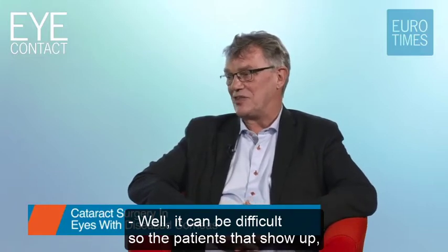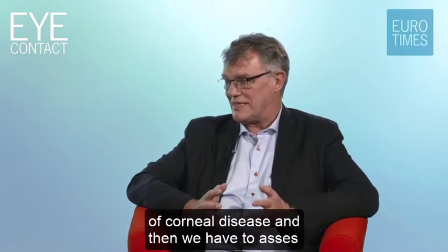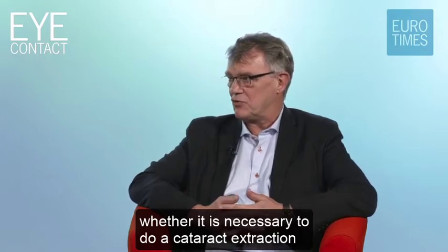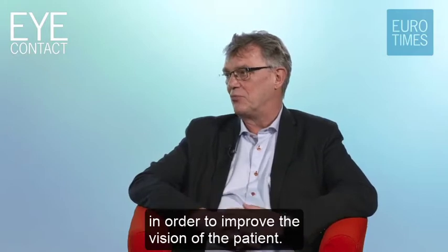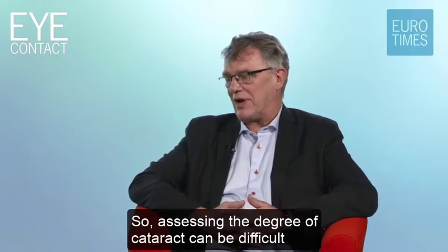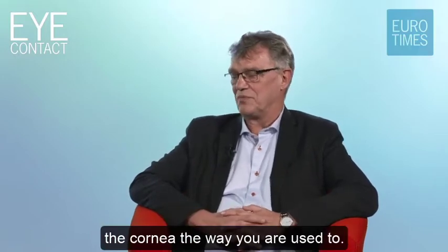So the patients that show up will of course have some sort of corneal disease, and then we have to assess whether it is necessary to do a cataract extraction in order to improve the vision of the patient. So assessing the degree of cataract can be difficult in these patients if you simply cannot look through the cornea the way you are used to.